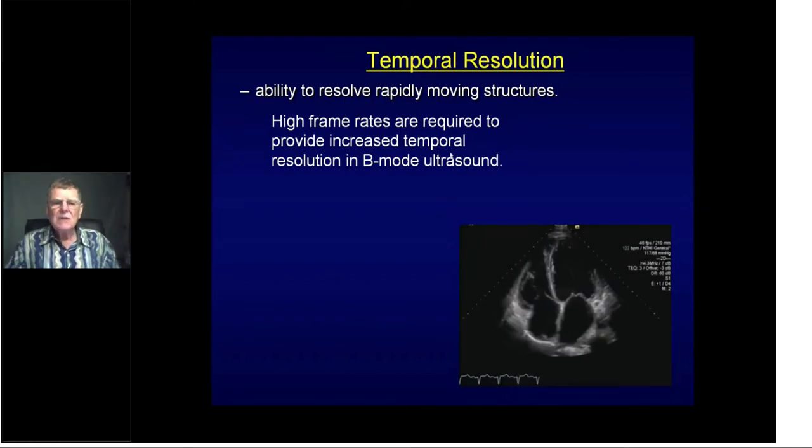Okay, now the third resolution I wanted to talk about is temporal resolution. Temporal resolution is time resolution, the ability to be able to look at moderately moving or rapidly moving structures.